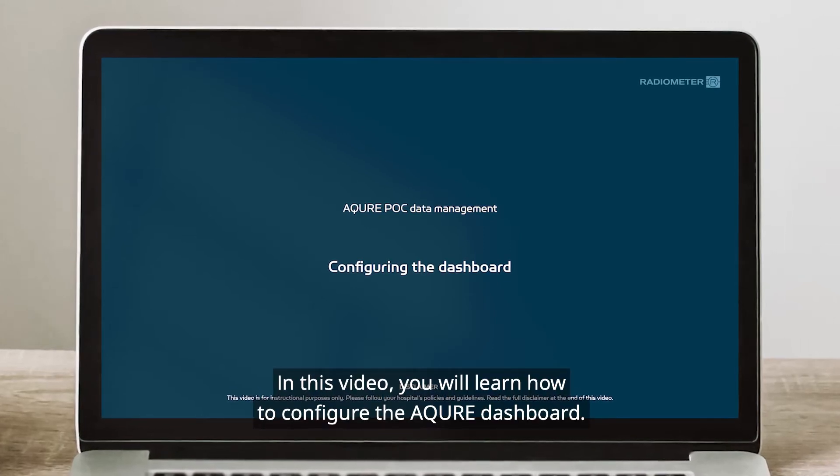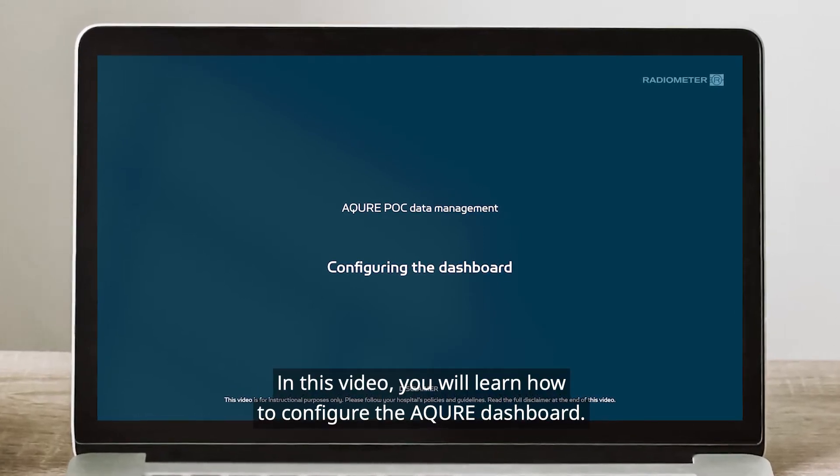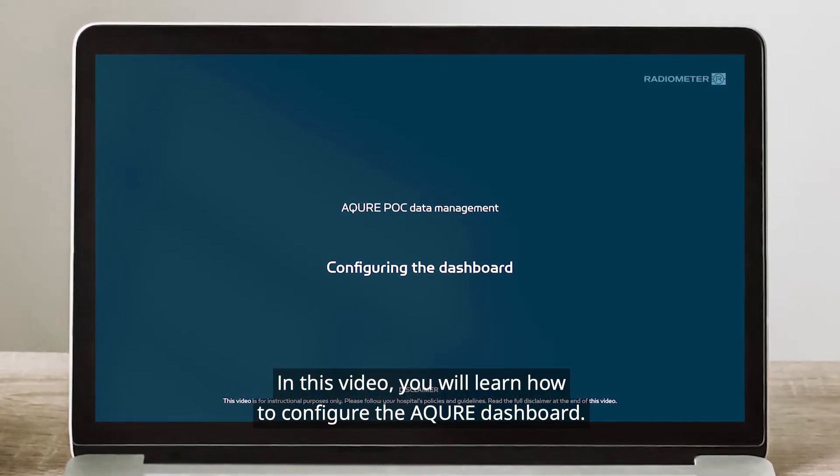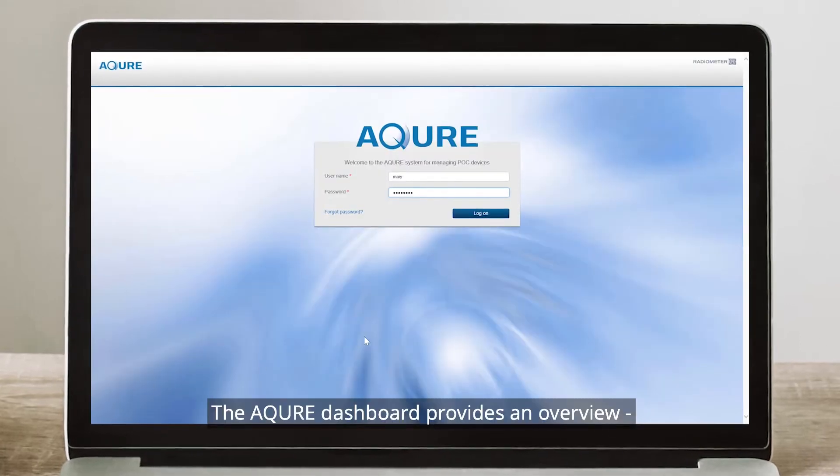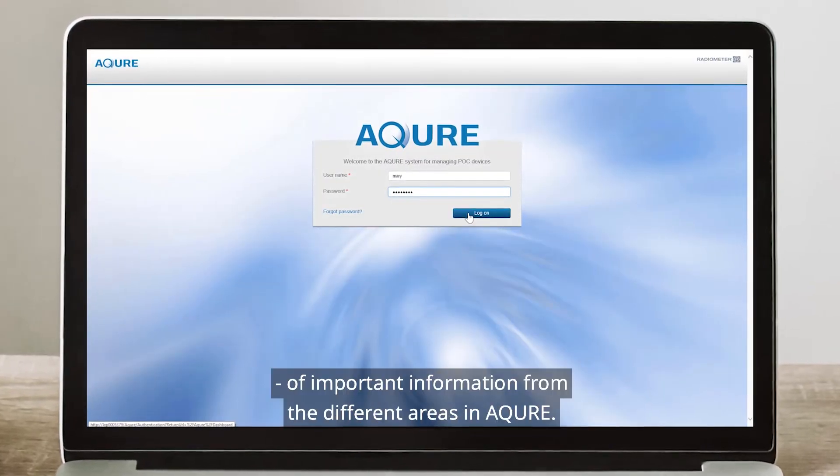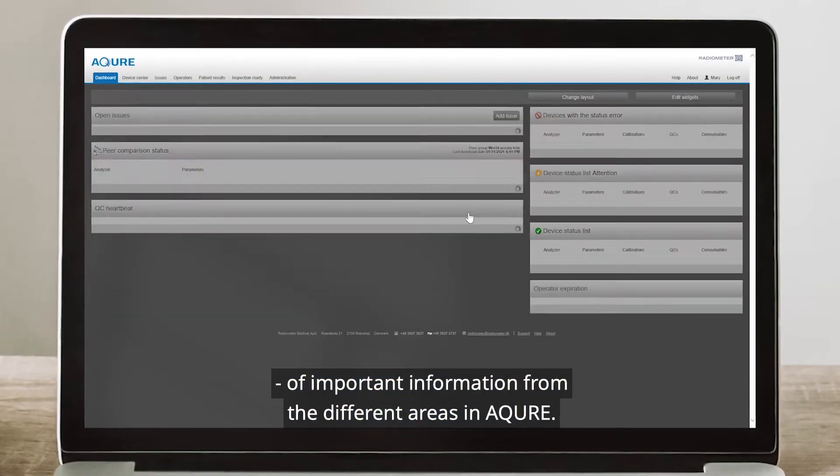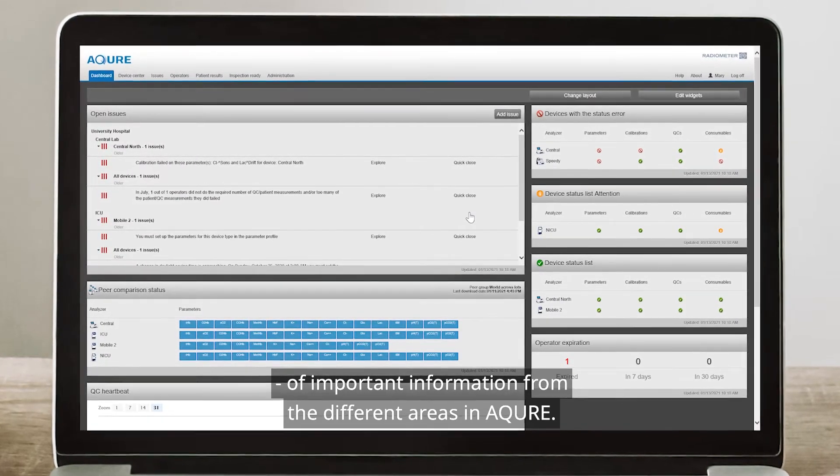In this video, you will learn how to configure the Acure Dashboard. The Acure Dashboard provides an overview of important information from the different areas in Acure.